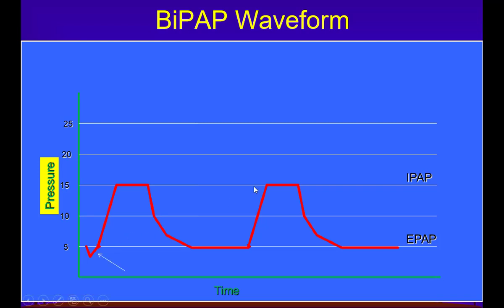This is the IPAP, the higher pressure. Then this is the trigger, and then you have the cycle which is now marked there, where the IPAP is converting into the EPAP, and then you have this rise time. Then you have this rise time from baseline when it goes into the achievement of the inspiratory pressure. Then this is the rise time. All right, and then what else we have?